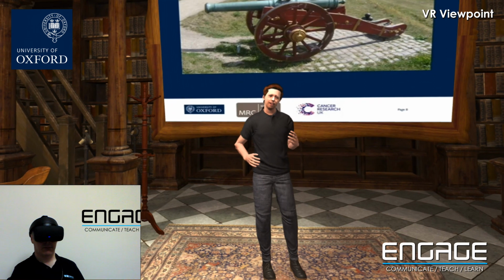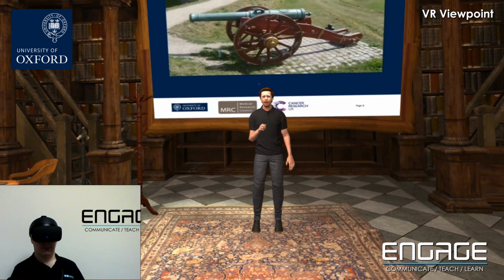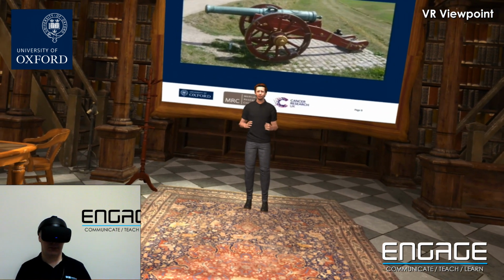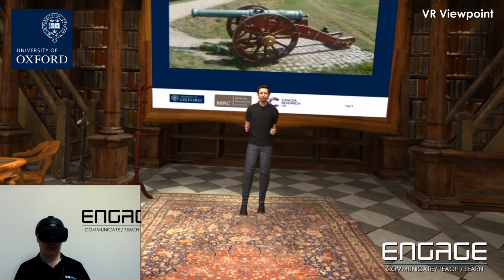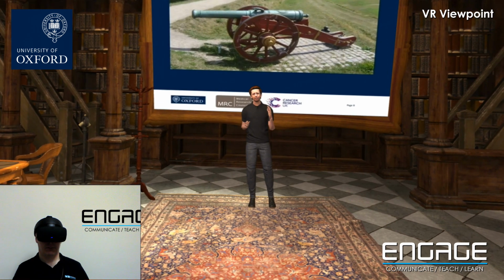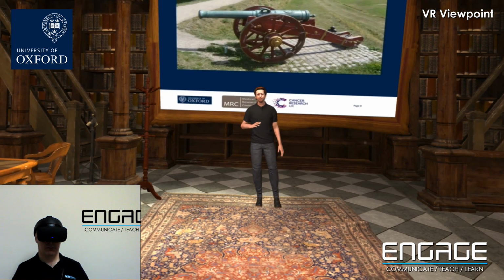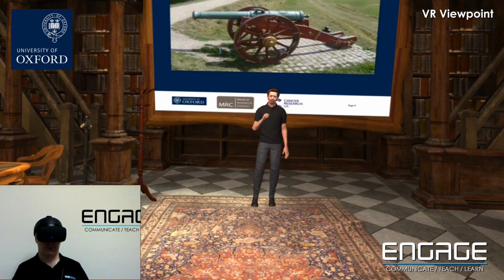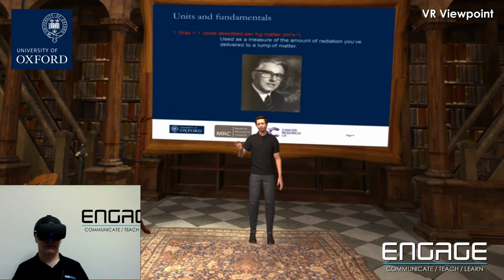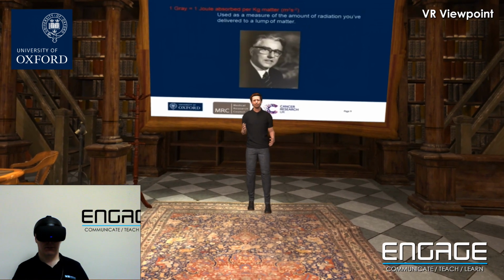Well, that's interesting, but we're not talking about cannonballs, we're not talking about castles, we're talking about people. So you might be quite keen to know that I'm able to understand how much energy we're going to use. When we prescribe drugs, we don't just tell you to take some. We prescribe 300 milligrams once a day. So here I want to prescribe so much radiation once a day. And in this case, we don't care how much radiation leaves the cannon so much as we care about how much radiation reaches the castle wall. I care about how much energy is deposited in the target.